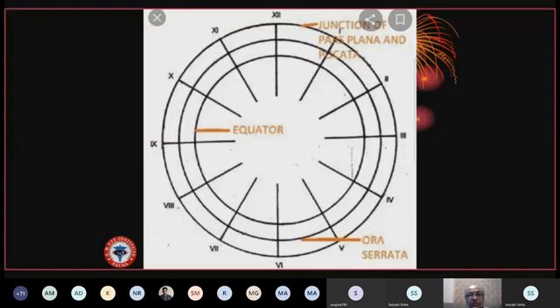So my question to postgraduates is, it's got a specific name to it. What fundus photograph can you take that you can see nearly till the ora? I will not say ora, nearly till the ora. What machine or what is the name of this? If you can post over there. We'll go ahead, Pooja. Okay, sir.